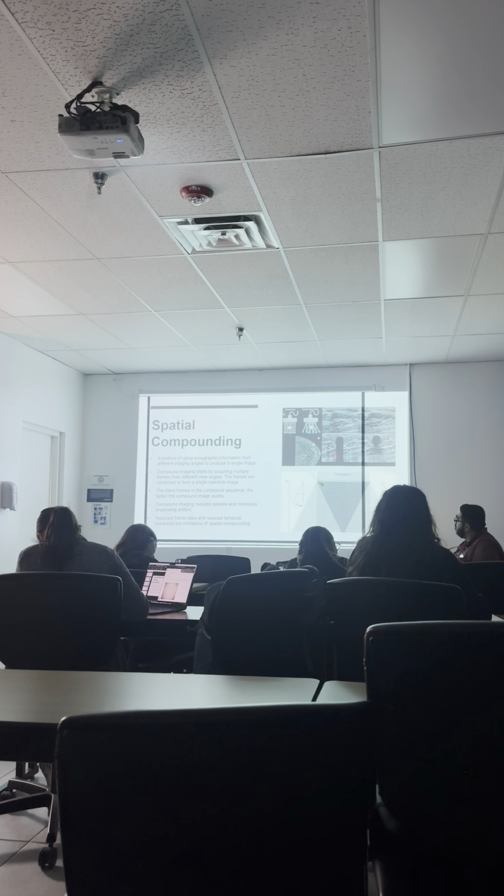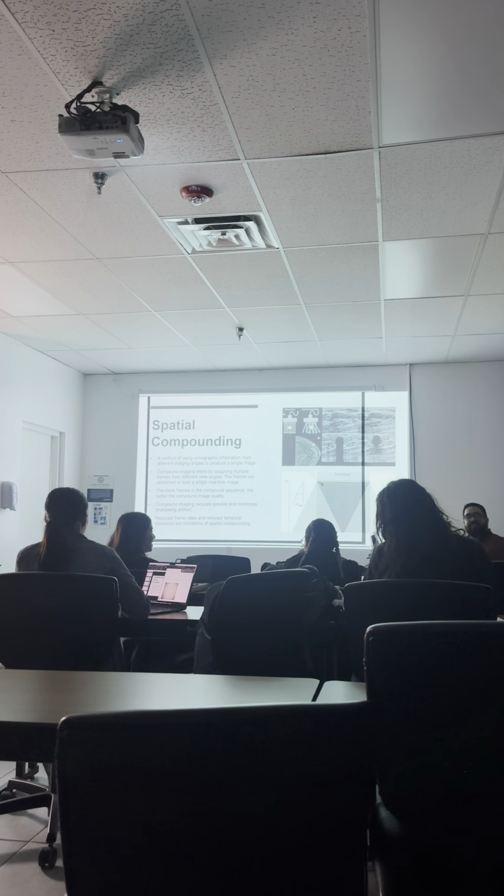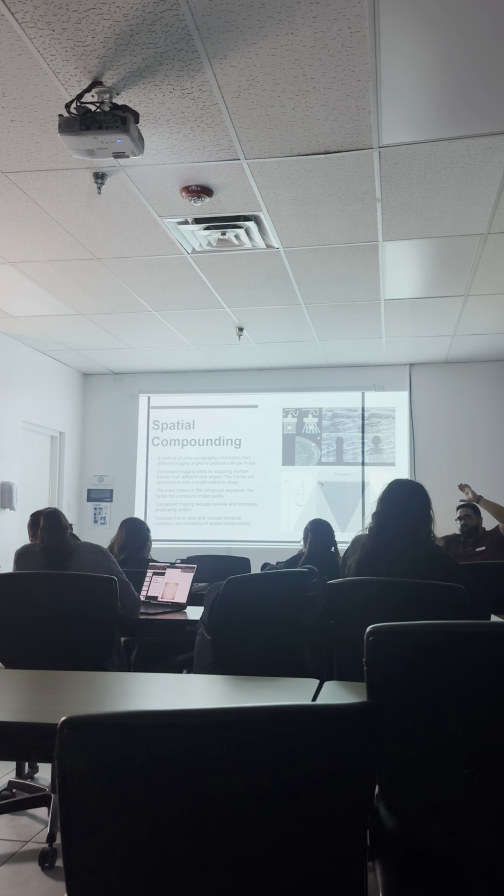Because of the echoes that it's now compensating for, it will reduce the gaps. Angles, yeah. Okay, so if there's something blocking us here, what do we do? We go around it this way and we go around it this way, right? So the posterior shadowing gets help from these lines coming in on either side, and we're able to fill in the information that we lost.